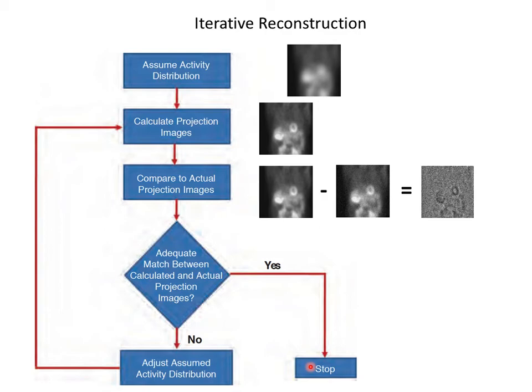And so you decide when you've reached as good as it's going to get in terms of minimizing that noise without overfitting, right? If you start to put in tiny little features such that you reduce the differences, but all you're doing is fitting noise, then the image won't really be a good representation either.